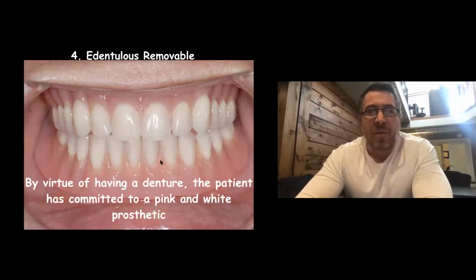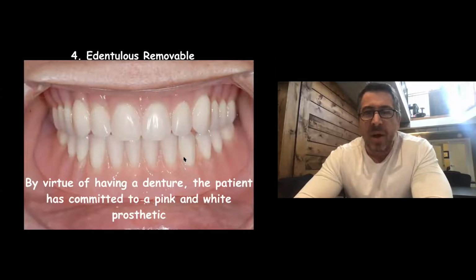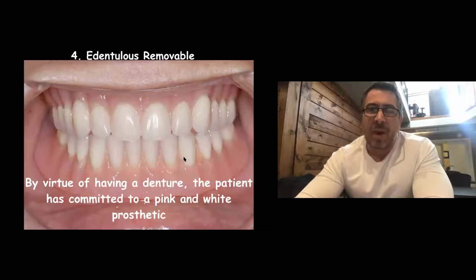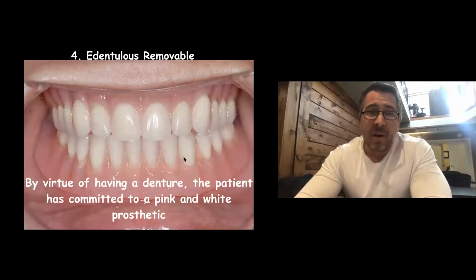But what we need to do with these cases is ensure that when we place these implants, we've provided adequate prosthetic room to provide the nice aesthetics of the acrylic and whatever components you're going to use to connect the implants to the prosthetic. And that's the biggest thing that I see with more novice implant dentists: not doing adequate reduction of tissue to accommodate the prosthetic requirements that are required for a removable denture.